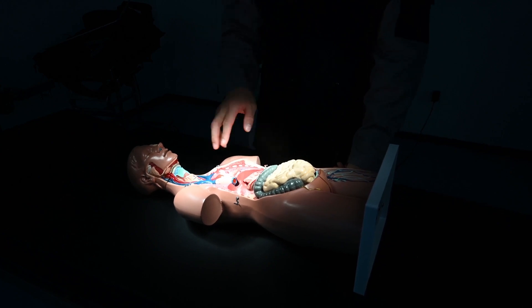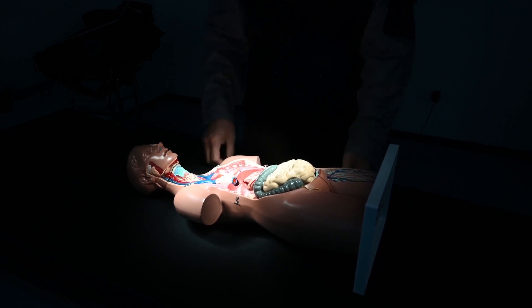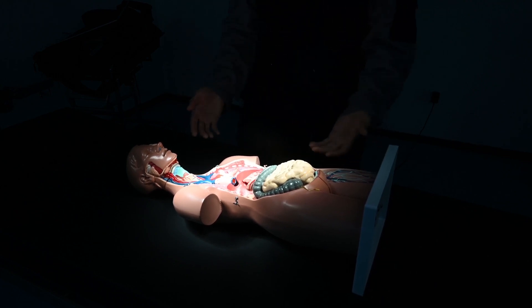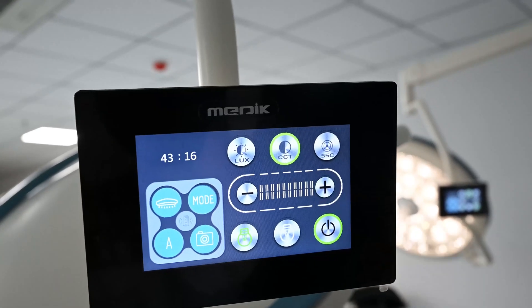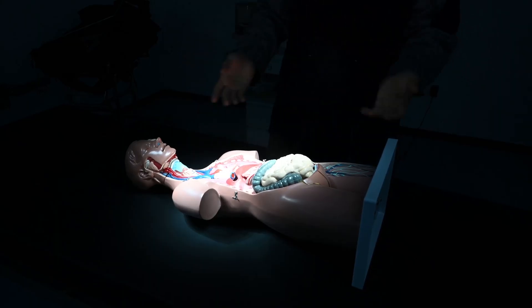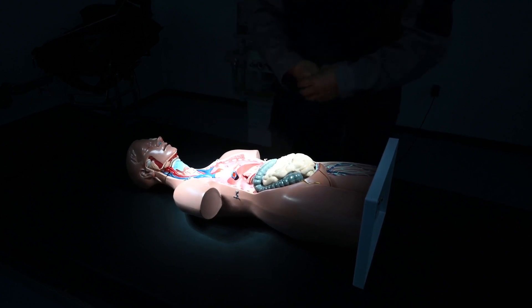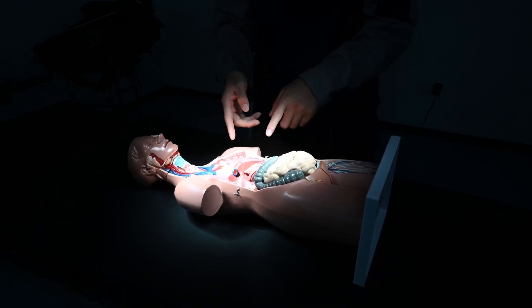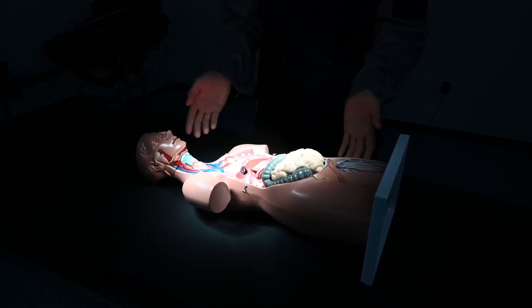Now we adjust the color temperature to a high level, about 5000 K. We can feel the light is very cold and very bright. In this mode, the color differences among organs, veins, and tissues are very clear.